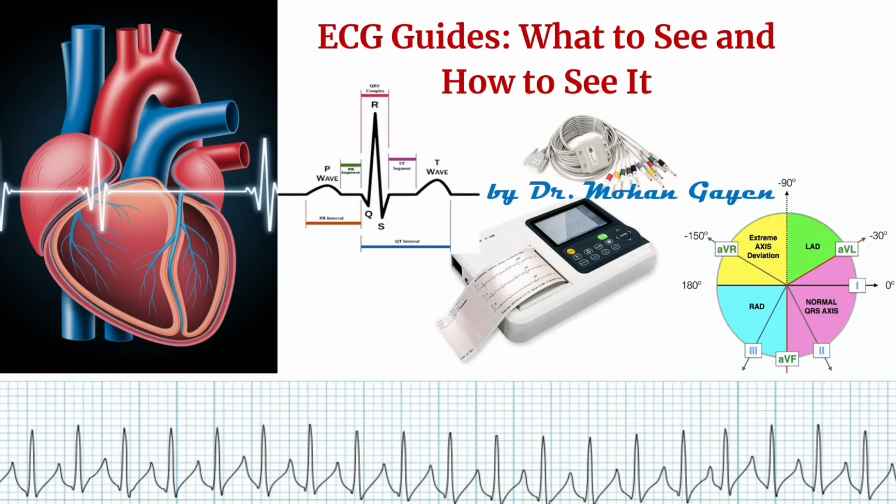Welcome to the ECG Fundamentals series, where I will transform the art of ECG interpretation into something clear, structured, and easy to grasp. Whether you're a complete beginner, a medical student, or a healthcare professional looking to refine your skills, this series will take you from zero to hero in ECG interpretation.